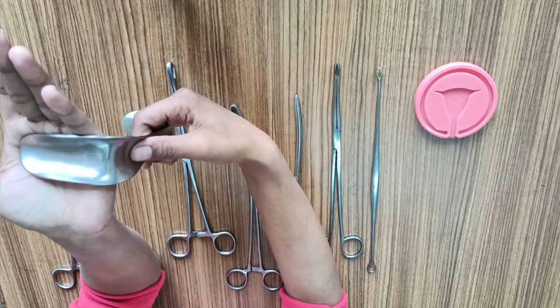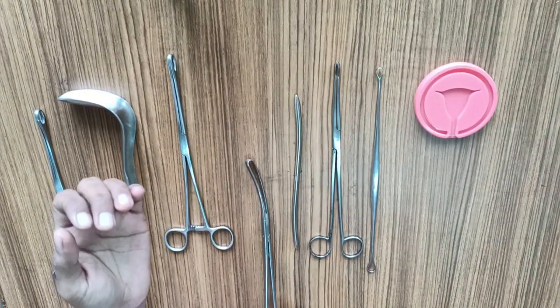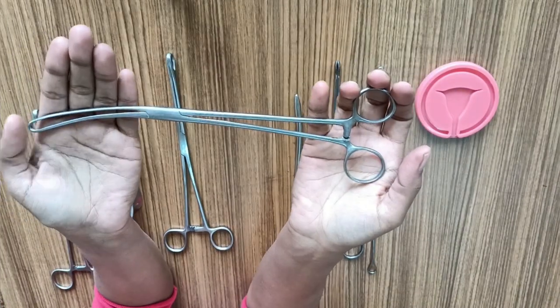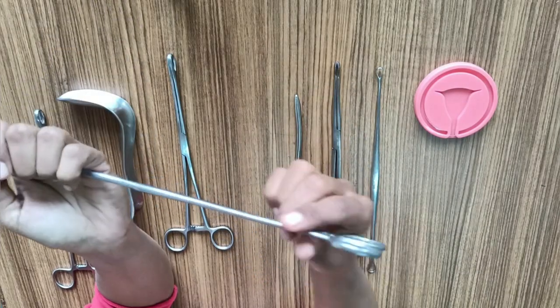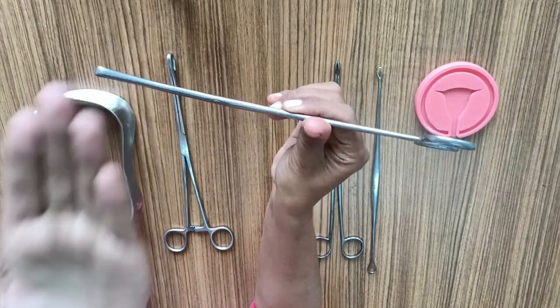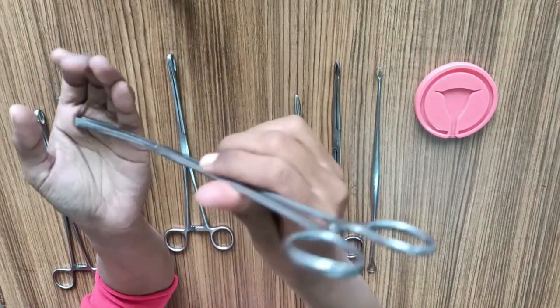Being non-self-retaining, you require an assistant to hold it from the shaft while you conduct the procedure. The next instrument is a vulsellum. It has two finger grips, a lock, and a curved forepart with multiple teeth to catch hold of the anterior lip of the cervix. This curved part is quite beneficial and you need to keep the concave part towards the ceiling or towards the pubic bone so that it can arc over the pubic bone and provide better visualization.